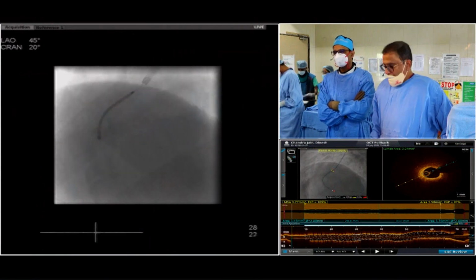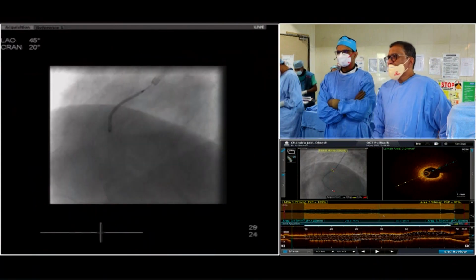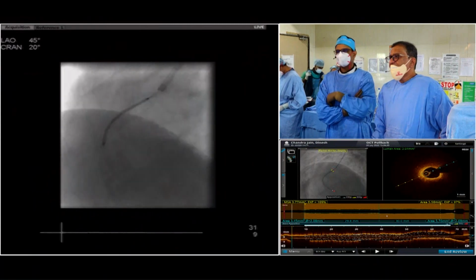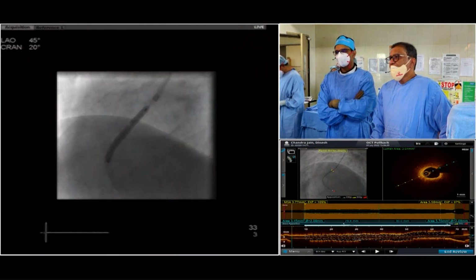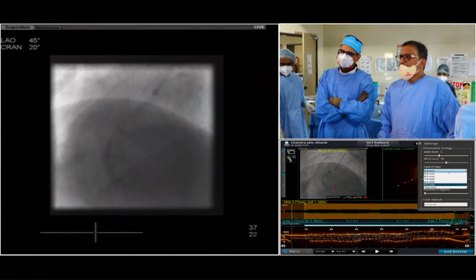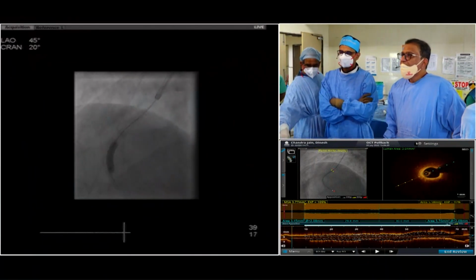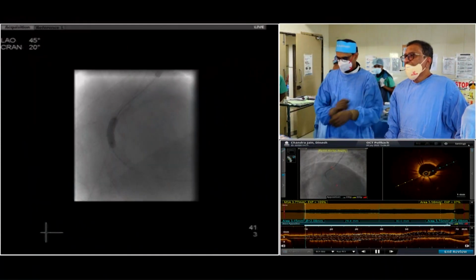Yeah. Next. And the proximal stent is again Alpine 3 into 38. Next, and we inflated nominally here. Next. And then, next. Keep going, Chinna. Next. Yeah. We just did the overlap. Then we probably did one overlap with the 3 millimeter stent, and then you implanted the stent, performed post-dilatation, and then OCT.